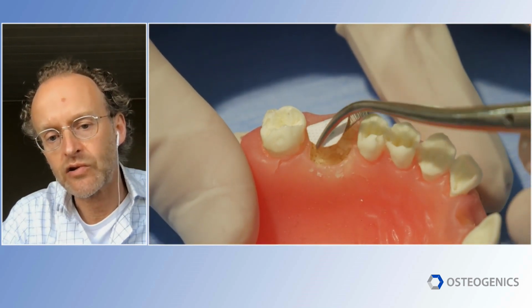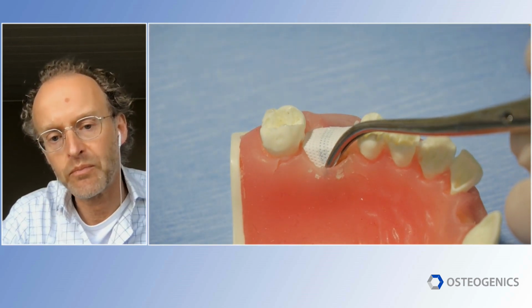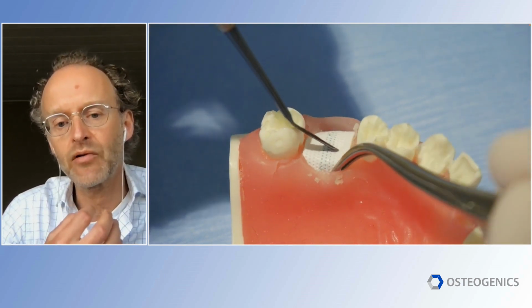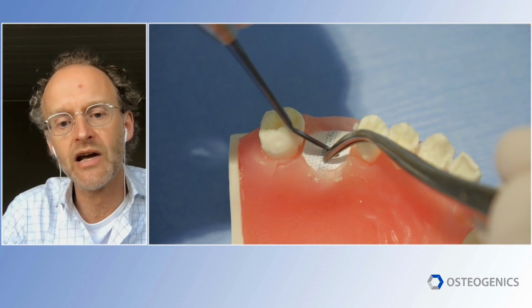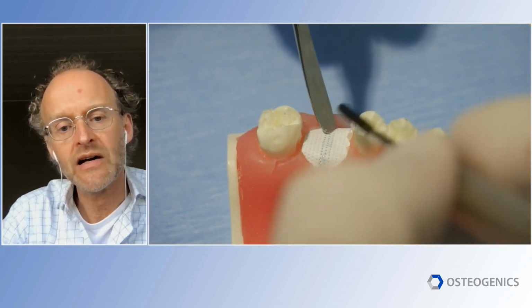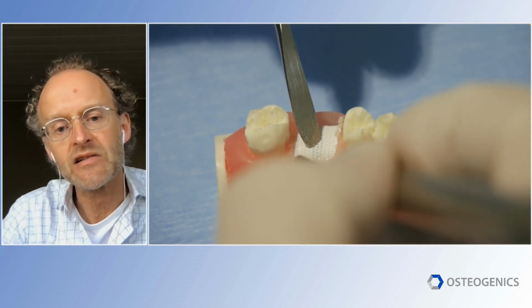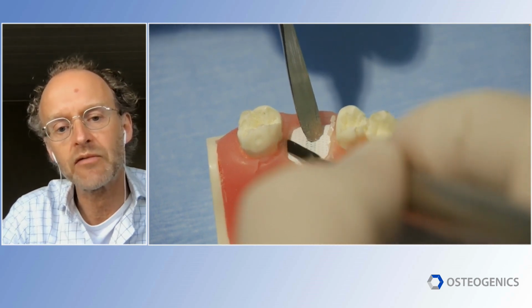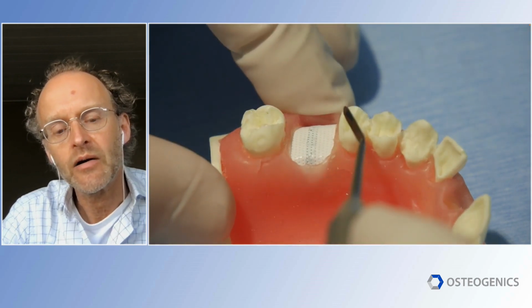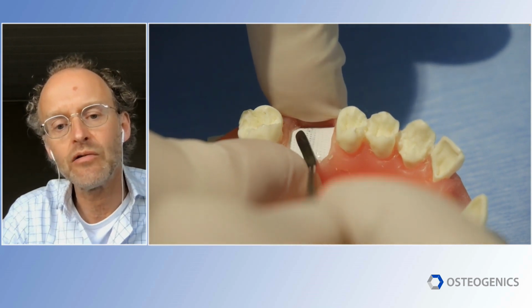Now we're going to take a surgical tweezer and we're going to place it under the palatal envelope. And you push it with an instrument down. And because it has a kind of memory, it will go to the square U-form shape. And now the difficult part comes, because here you can see you have to lift up the papilla over the membrane. And this is a real detail. You can use the Mini-Me from Istvan Urban for this. It's a really nice instrument. And you can push it underneath and then push again on the edges to really get the U-form shape in it.